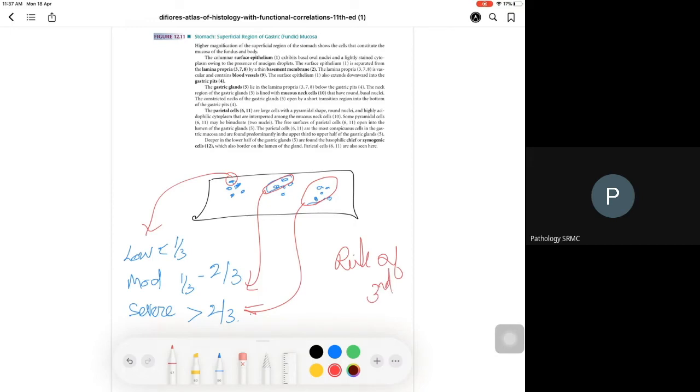It's very easy when you follow only a 2-scale system, 50%. If it is less than 50% or more than 50%. Less than 50% mild, more than 50% severe. So this is the rough guide that I use. It may be wrong or it may vary from organ to organ, condition to condition. So you use it carefully by reading the references.